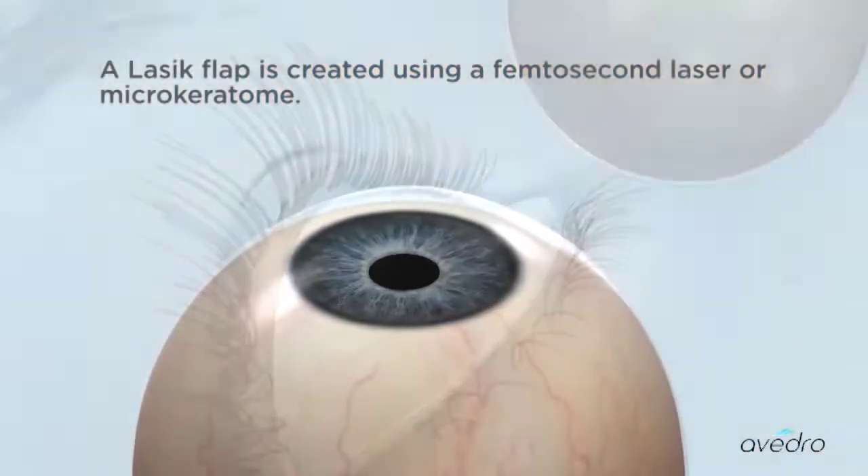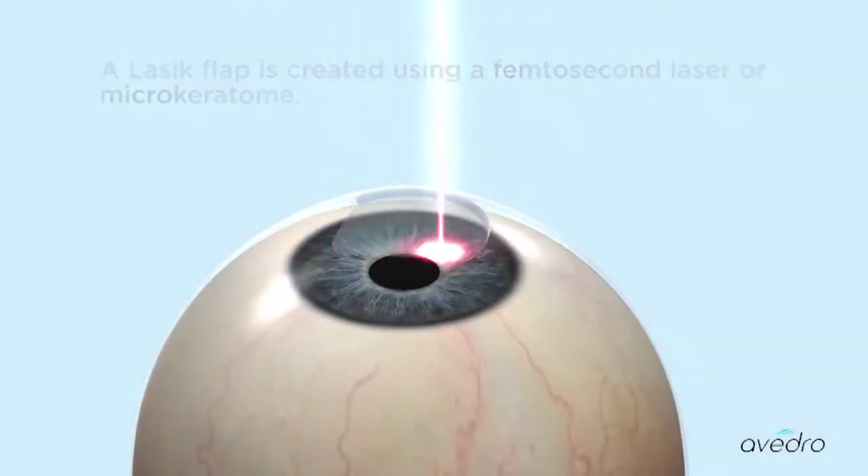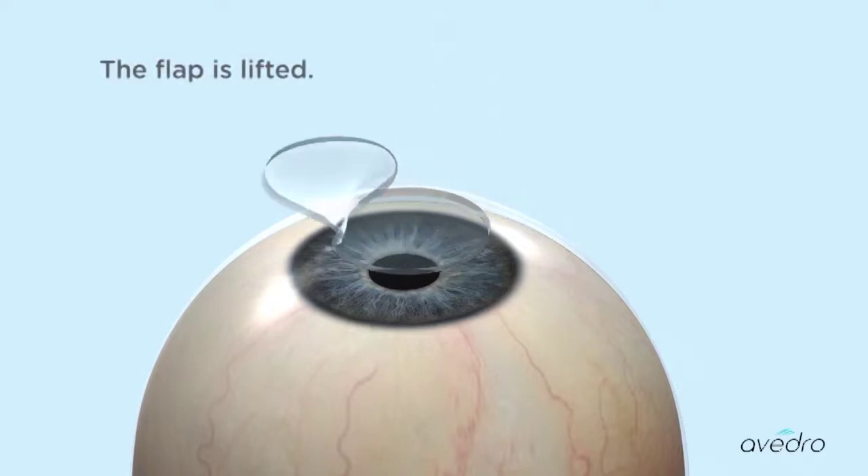A LASIK flap is created using a femtosecond laser or microkeratome. The flap is then lifted.